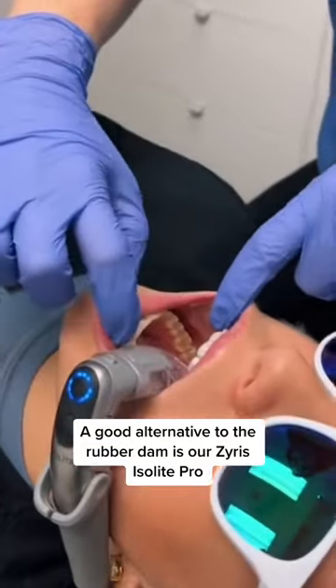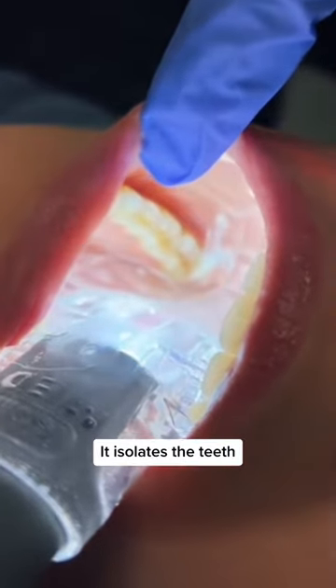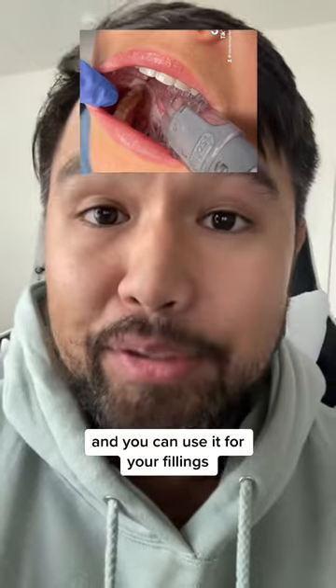A good alternative to the rubber dam is our Zyrus Isoli Pro with the posterior mouthpiece. Not only does it keep the field dry, it isolates the teeth, it provides a bite block, and it's a lot easier to insert than the rubber dam, and you can use it for your fillings.